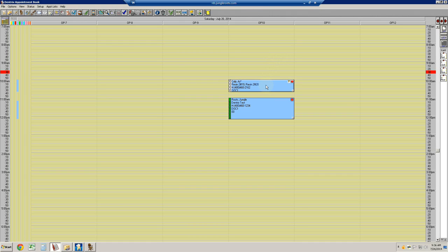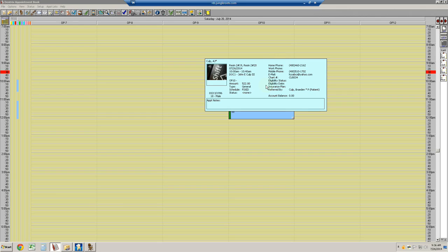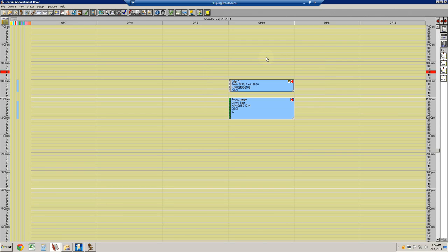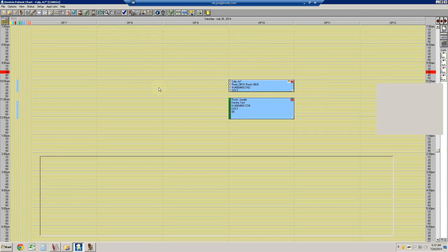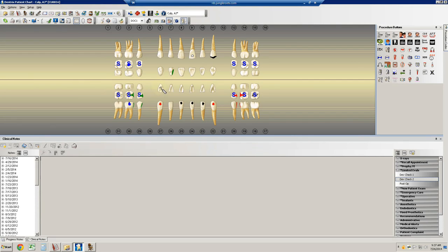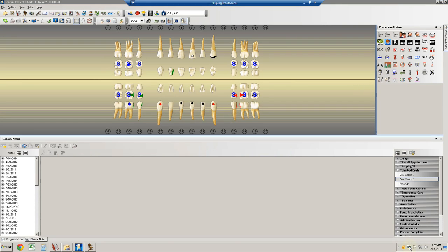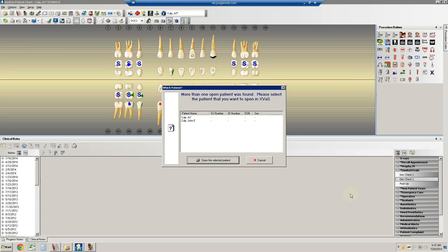We're going to start with AJ's chart. The X-rays are drawn based upon whose tooth chart is actually open. We're going to select AJ, we're going to select the tooth chart, and then the tooth chart will come up. Down here in the lower right side, you should always see this little icon named Name Grabber or NG. We're going to click that. It's going to invoke the Name Grabber software. In this case, we are interested in seeing AJ's X-rays, which I'm selecting here.